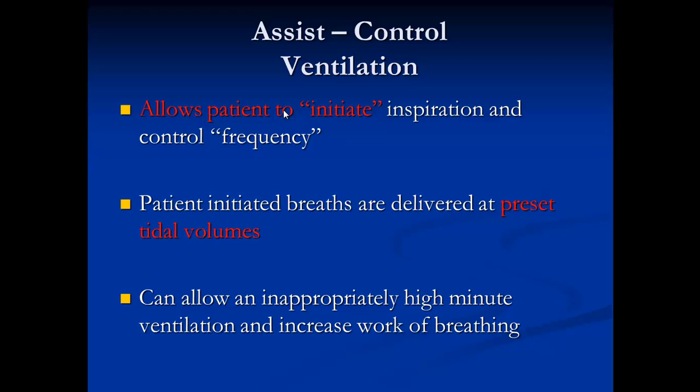This mode of ventilation is commonly used when mechanical ventilation is initiated in patients with acute respiratory failure or any other etiology. So basically, it's the most common initial mode of ventilation. With proper use of assist control, the work of breathing may be significantly decreased.